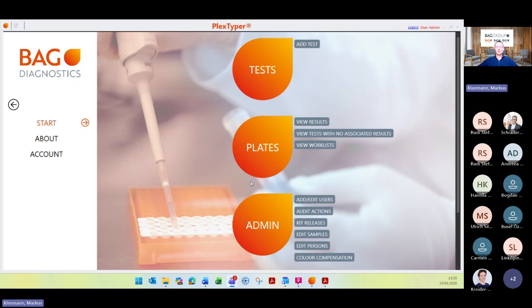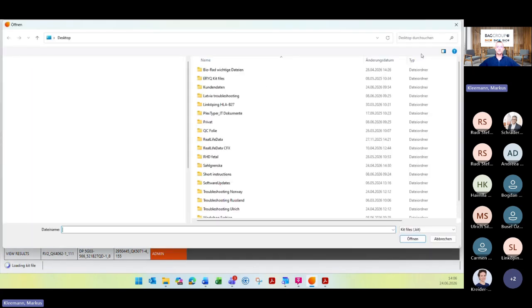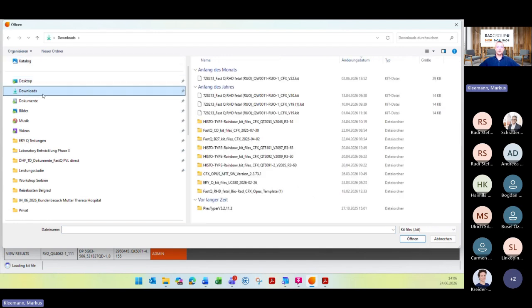I will start here on this PlexTyper desktop. I think you may know this. And I jump here to this function under admin, these kit releases function, because I want to say some words about this database here. Here you will find all your uploaded kit files. These kit files are somehow like a data package where the different thresholds are integrated for the different product and also for the different lots. So whenever you got a new lot, then you also have to download the specific kit file from our website. You can also do this here in this kit database with this load kit function here. So you can just maybe go to your downloads folder and then upload a kit file with this kit name here at the end.